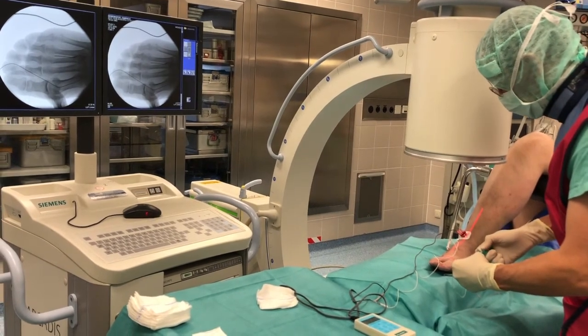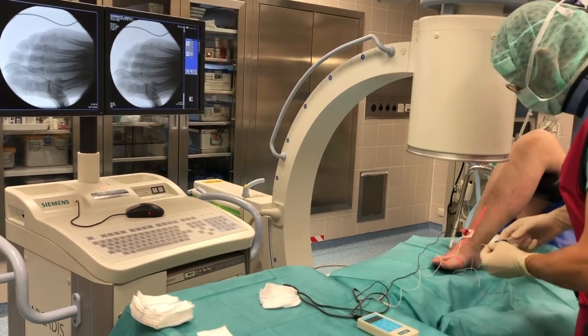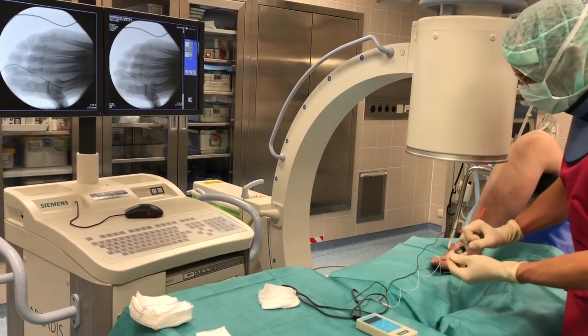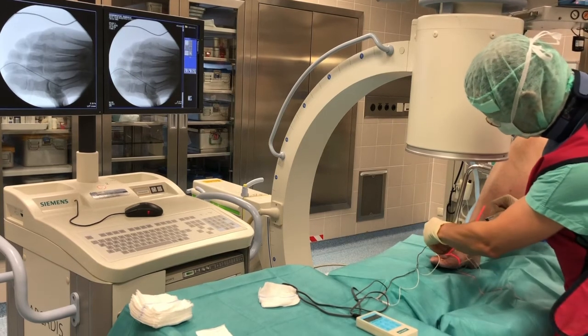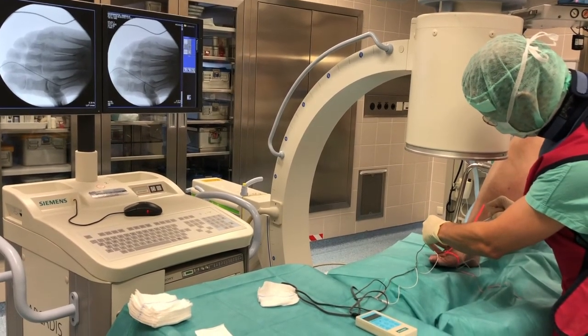Then I inject the 2.5 ml of ethanol as you can see here, and rather quickly I disconnect and take the local anesthetic. I allow the patients to swear at me and to shout and cry a little bit because it is painful for about 10 to 20 seconds.